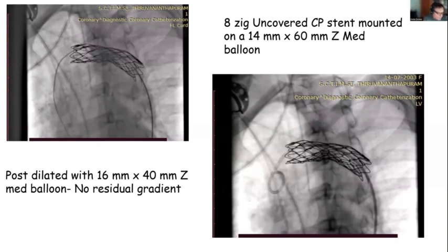As you said, it's very challenging for the surgeons. I know only 2 patients having a jump graft from the ascending to the descending. The connection to the descending aorta was put very low, at the height of the diaphragm. So it was a big cut in the front and a long bypass. One patient had Williams-Beuren syndrome, and he anyway received lots of stents afterwards to make the aorta grow. I think it would be a possible solution in this case, because the ascending and descending aorta are nearly equal sized.